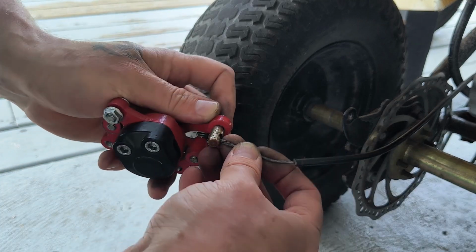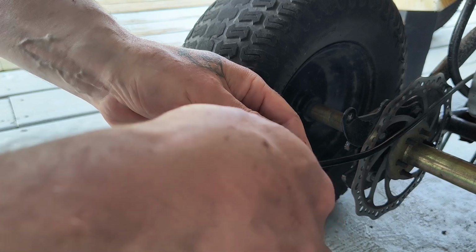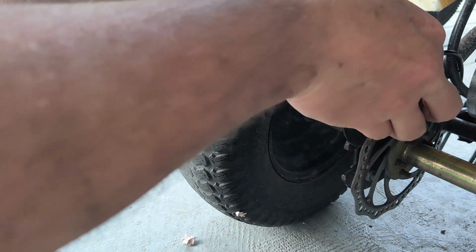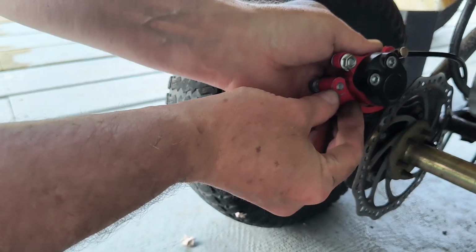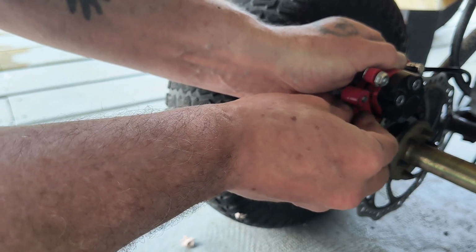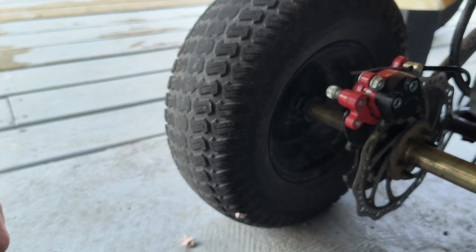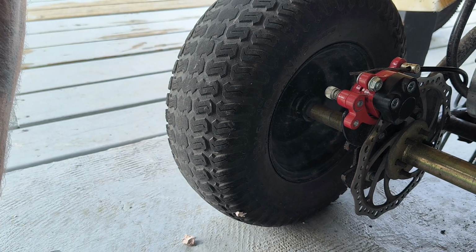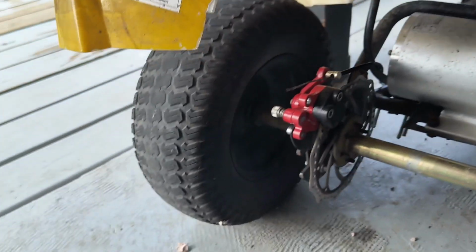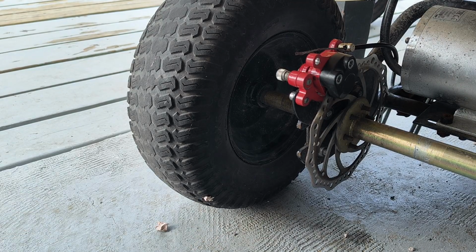Ow. Sitting there and sitting there. Look at that. A whole bunch of extra cable out of it. Okay, I'll bolt that back up in place before we start tuning the brakes. Just going to put those posts back in. The sound and lighting out here are absolutely terrible, but... Oh, ow.